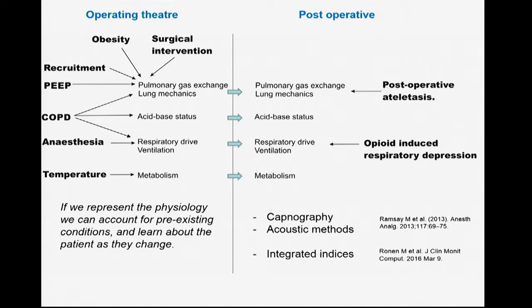Post-operatively, of course, we look at these effects with capnography and acoustic methods, and there are some of the companies that are now trying to make integrated indices to look at the post-operative period and identify events. I think it's all very good work, but maybe we can get a step deeper and look at the physiological progression of the patient. And maybe look toward getting some continuity of monitoring by deep physiological understanding.